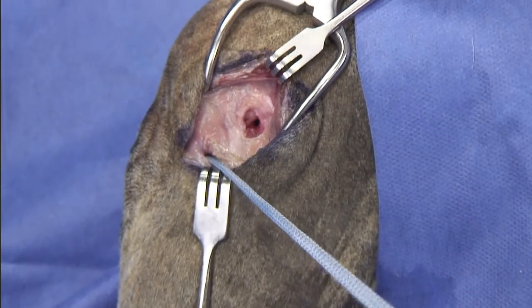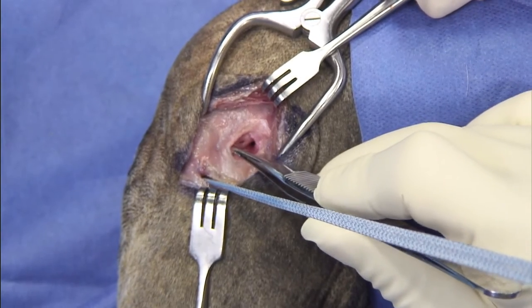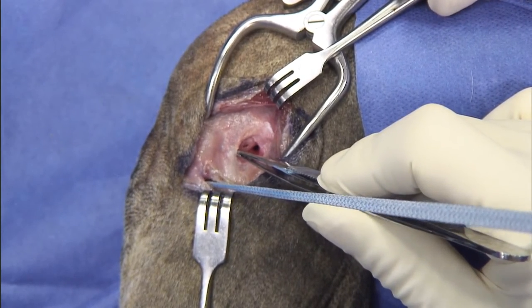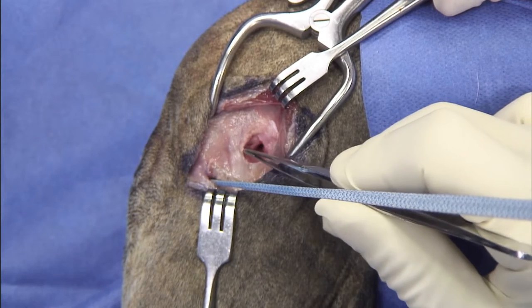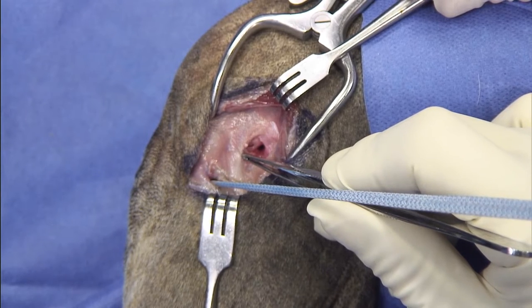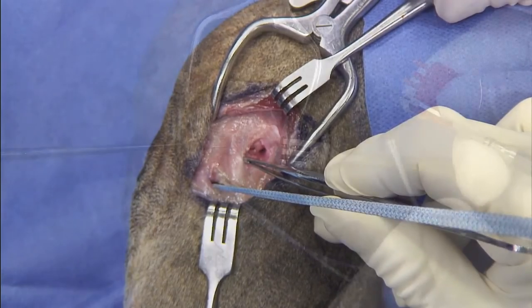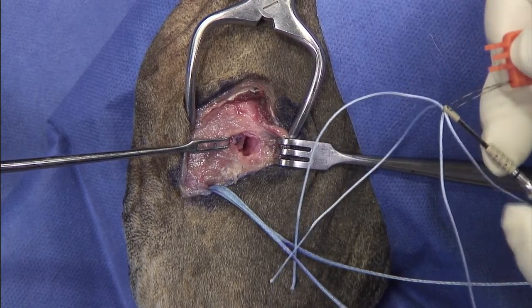We're ready now to place the swivel lock — in this case a 3.5. It's very important to retract the soft tissue, because as you are inserting the swivel lock, tissue can move into the interface between the swivel lock, suture, and bone. This can decrease the pull-out strength of the anchor. You can use this loop to make your life a little bit easier when passing it through the eyelet.